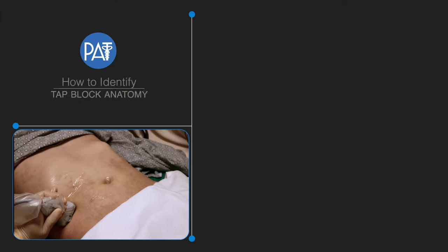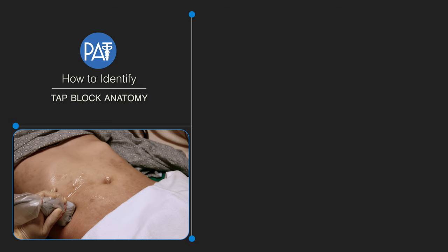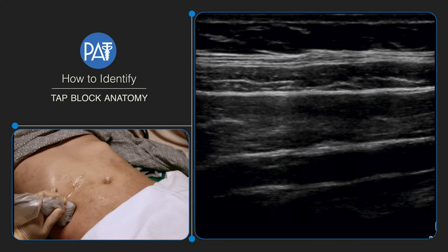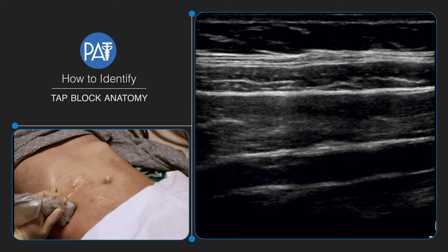The patient is positioned supine with the transducer at the midaxillary line between the subcostal margin and iliac crest. Can you identify the layers of abdominal wall muscles to safely target the correct neurovascular fascial plane?